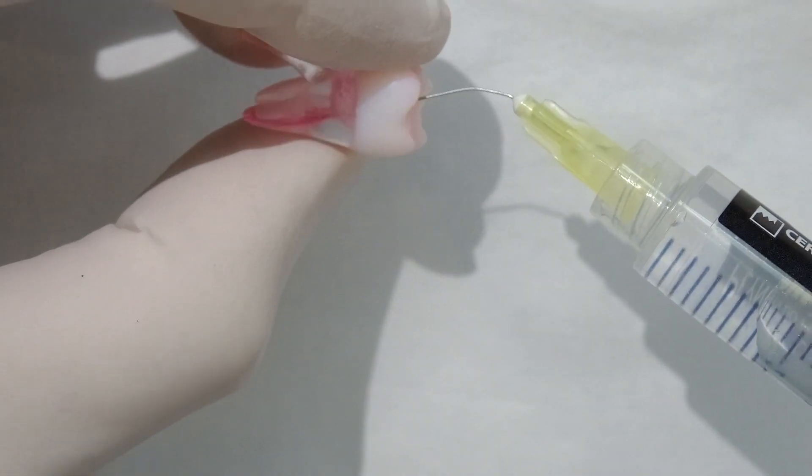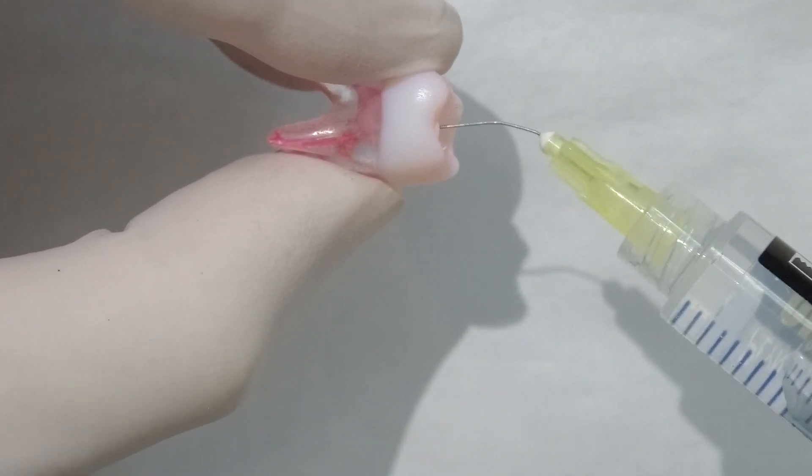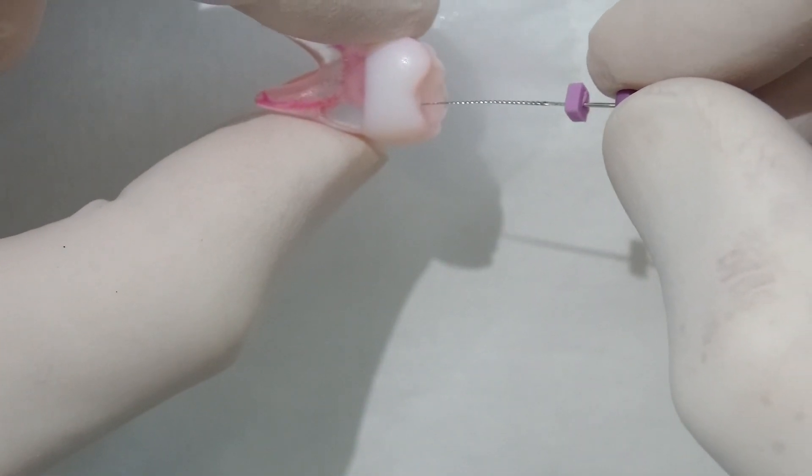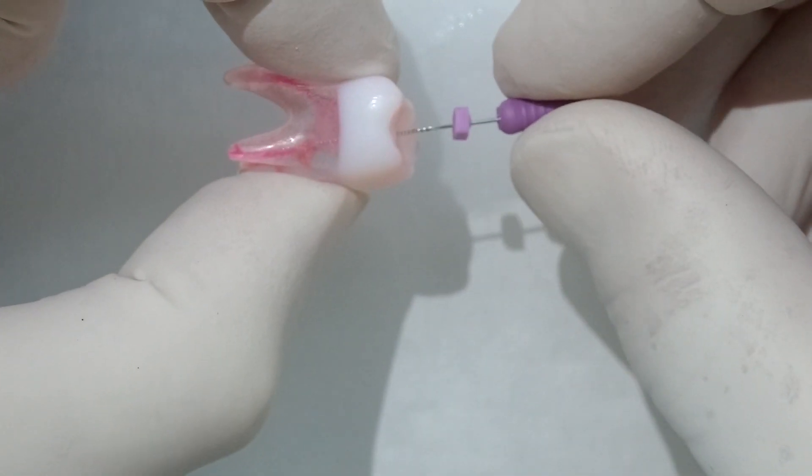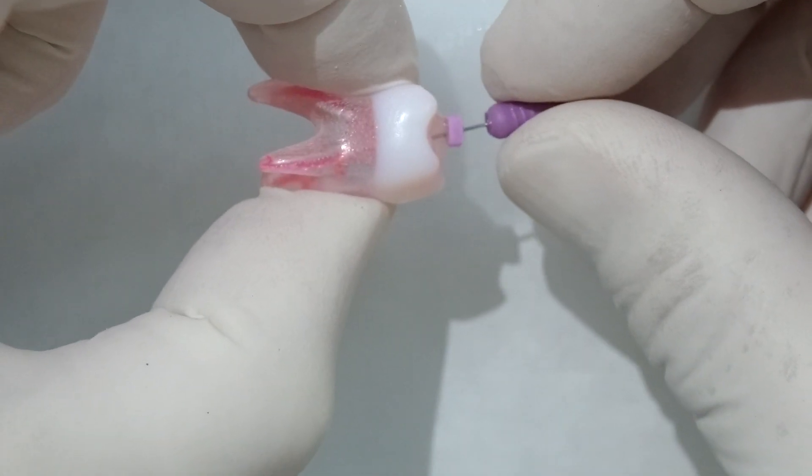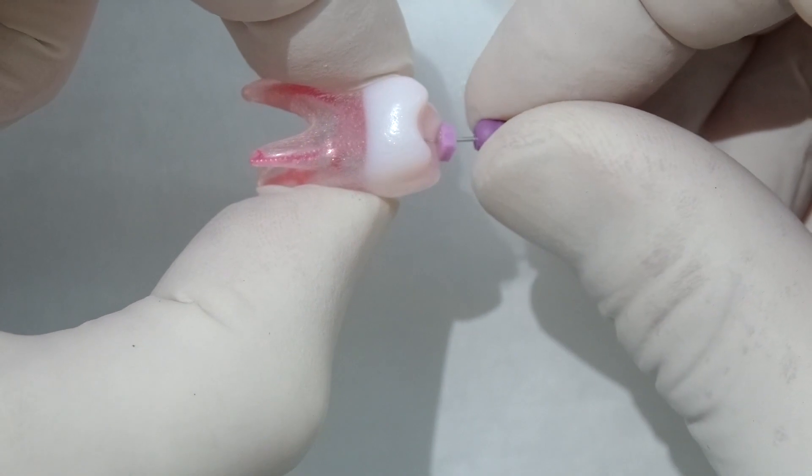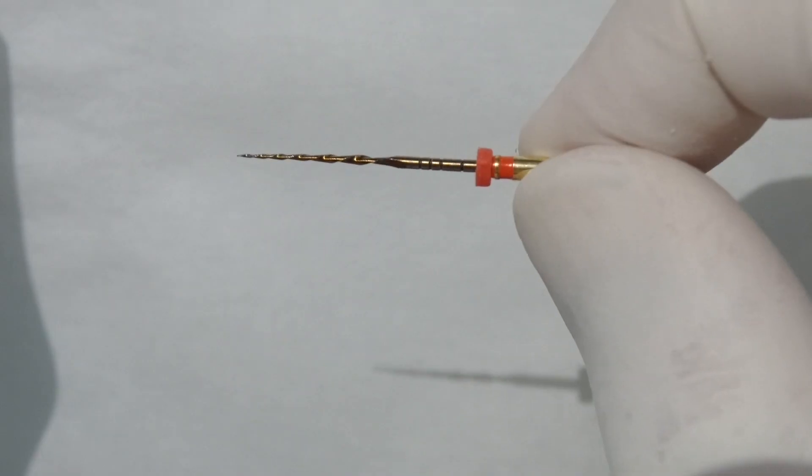This is just using some sodium hypochlorite just to irrigate, make sure we get rid of all the debris. Then we'll always make sure that whenever we do any irrigation, after we've irrigated, we're going to go back in with our patency file. That's that size 10 file, measured still to the zero point, so we know that's going all the way to the root canal terminus, so we're not getting any blockages at the end of the root canal, which is really important. We'll just sneak that just a little bit long, and we can see that everything is nicely clean, nicely free from blockages.